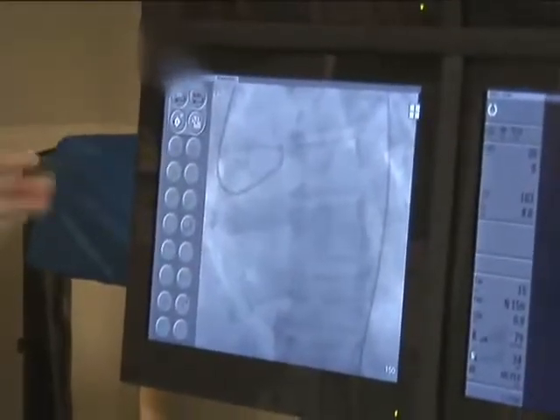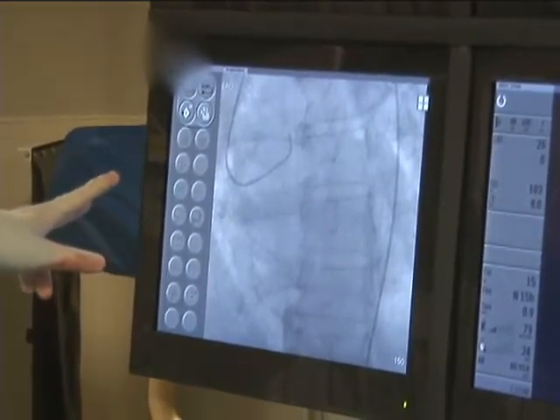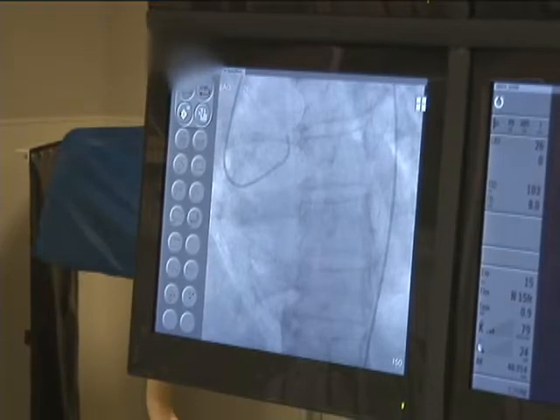Coronary catheters are always advanced over a guide wire, typically a J-tipped guide wire, with the tip of the guide wire as the leading edge in advancement. The catheter and wire combination is advanced to the aortic root, where the guide wire is removed and the catheter is attached to the hemodynamic and injection tubing.